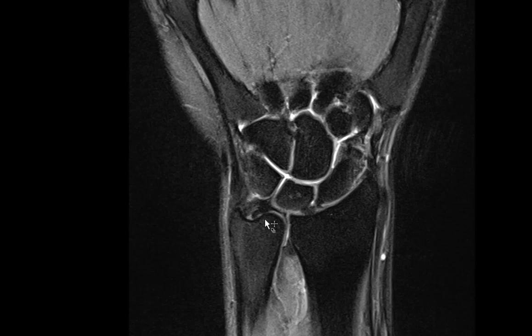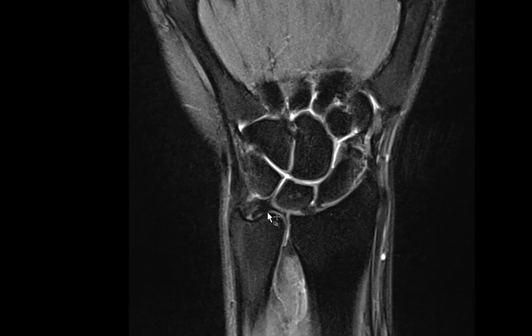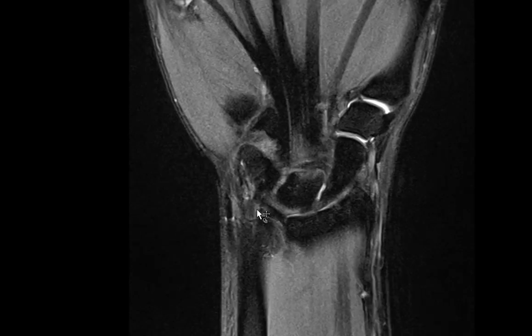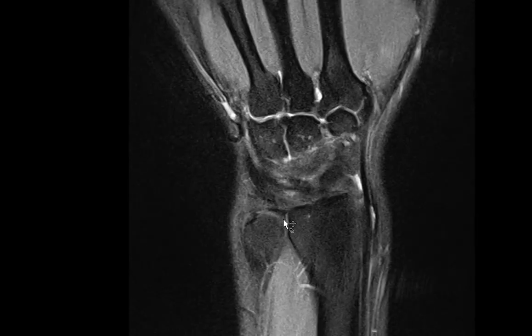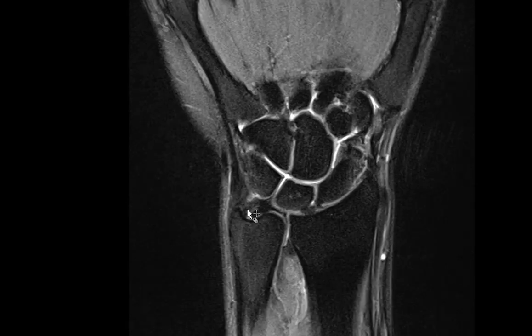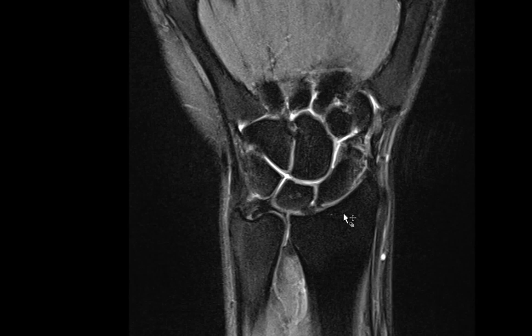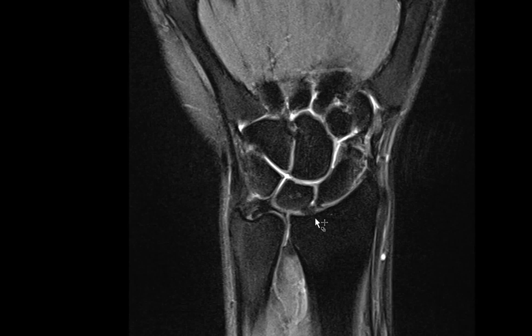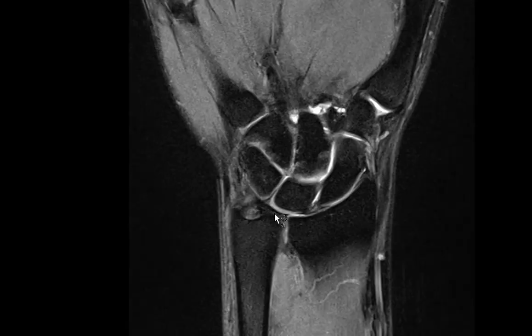We're looking for any tear or perforation of the TFCC. There is some intrasubstance signal within the disc which may reflect a degenerative type of tear, with mildly T2 hyperintense signal — but no large perforation. I can see the radial attachment and the ulnar attachment with two slits. On arthrogram, if you inject contrast into the radiocarpal joint and fluid extravasates into the distal radioulnar joint, that suggests a tear or perforation of the TFCC.